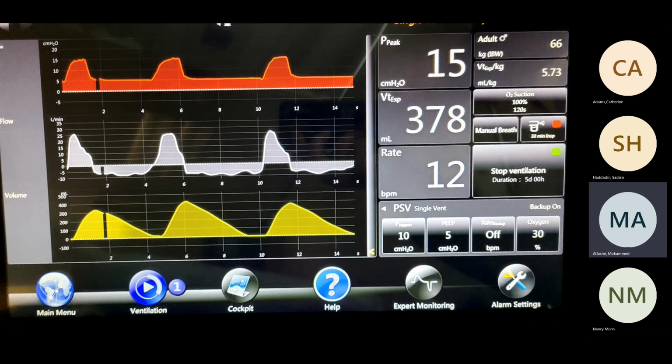That's the time when the physician should intervene. What does that mean? Is this patient in severe septic shock, sepsis, and the movement of the muscle is out of control, just secondary to the patient feeling tired and trying to breathe more and more? Or is he trying to get more volume, or are the settings you are on right now not the right setting for him?